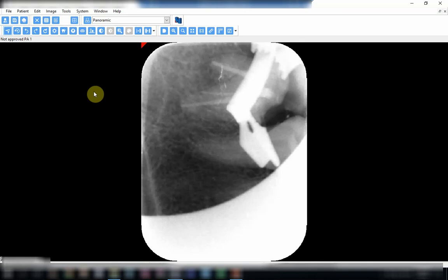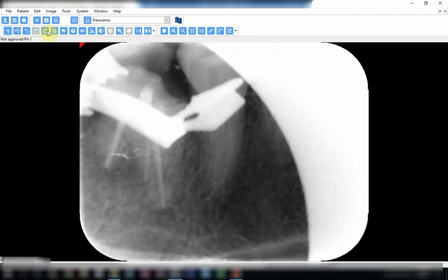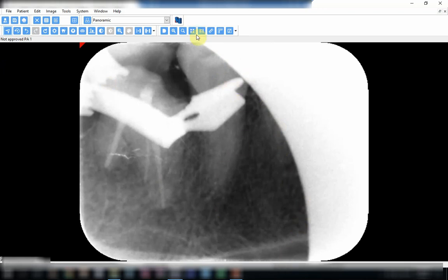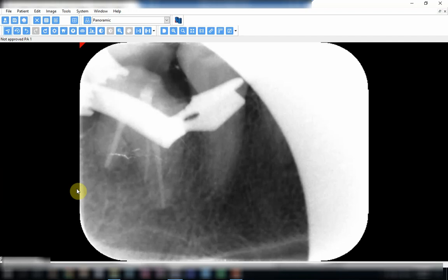Another cone cut over here, plus the film was pushed too much downward so you don't see the crown. Let us concentrate on the cone cutting. See, all this was cut off. It means the cone was directed to cover another area where there was no film, so it was not covered. See the effects of the cone cut—if you want to see this tooth, then you have to take another radiograph.